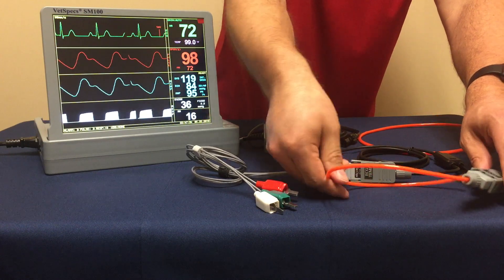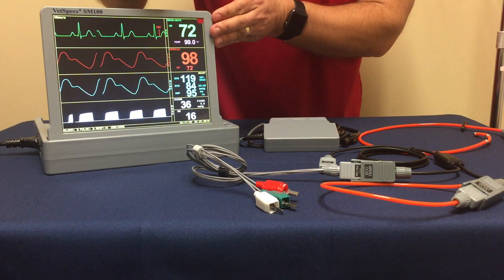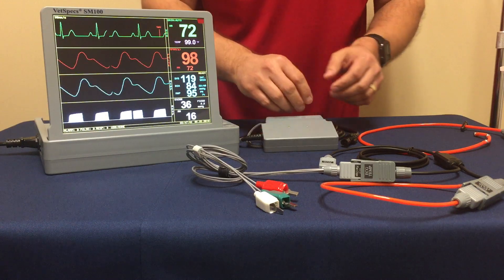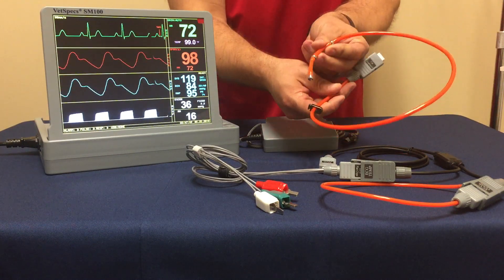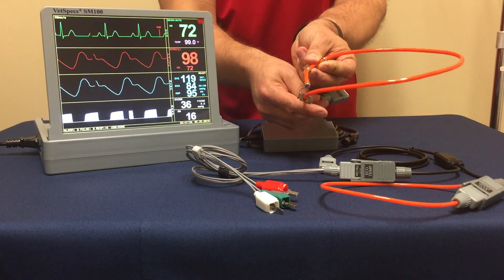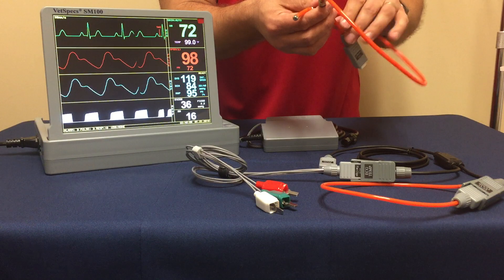This allows the monitor to provide your ECG heart rate along with your temperature through one cable connection to the main module. This is in lieu of the esophageal probe that is provided with VetSpecs systems, which is more geared for surgical applications. Thank you so much for your time and we look forward to seeing you again.